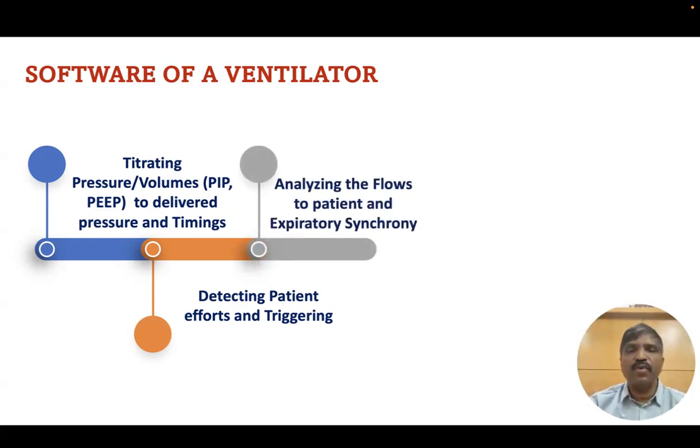The software analyzes the flows and the volumes going to the patient. Because it analyzes the flows, it also helps the machine understand when it should stop, or terminate, the inspiration, that is, the pressure delivery, the PIP pressure, or the volume delivery to the patient.